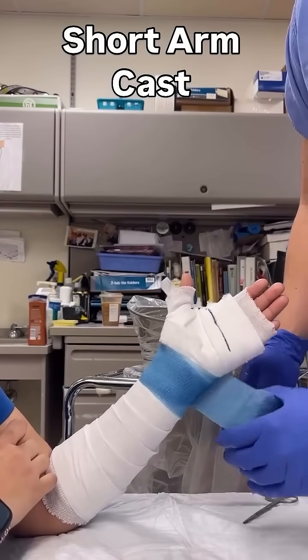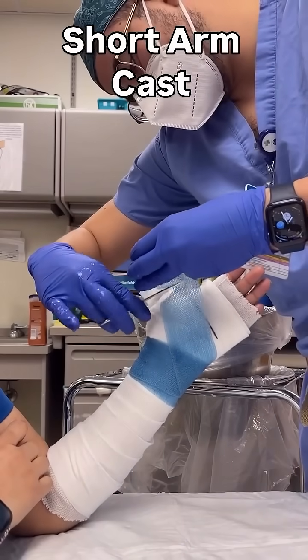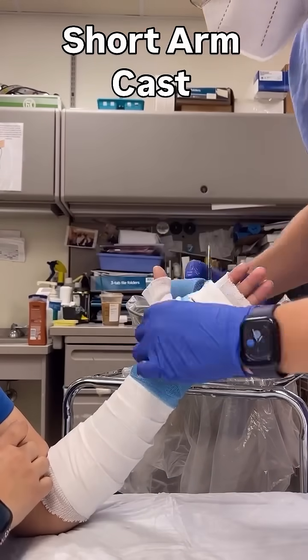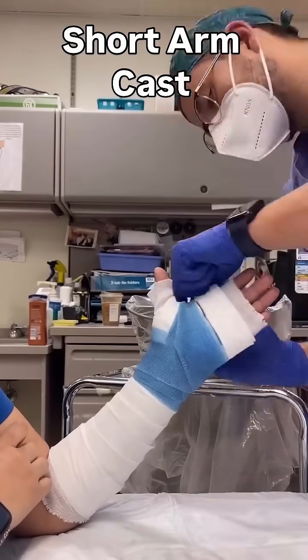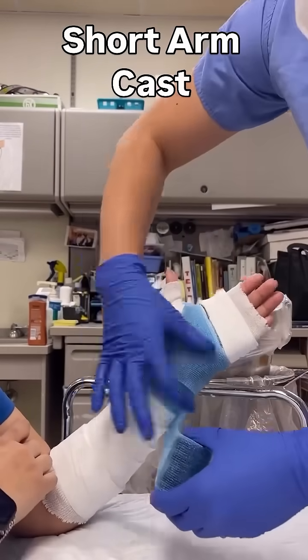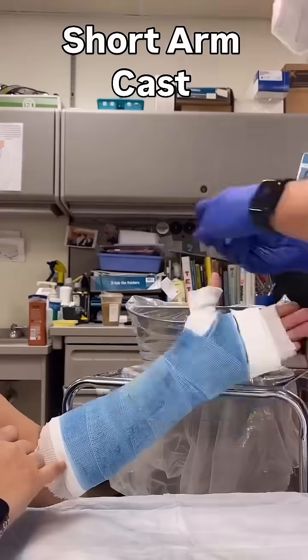Now we'll begin wrapping the fiberglass. When going around the first web space, I like to cut the fiberglass so that only a thin strip is over the web space, to allow the thumb plenty of space to move. When you move proximal, make sure to leave enough space to fold over the web roll later — that way you'll keep that area well padded.